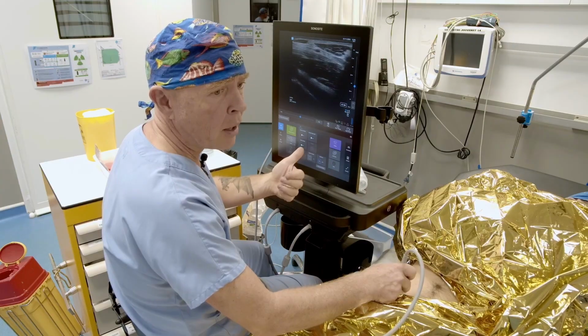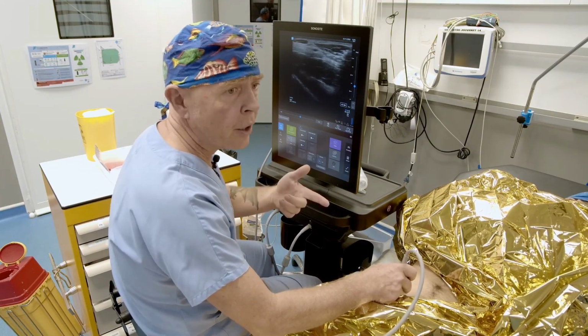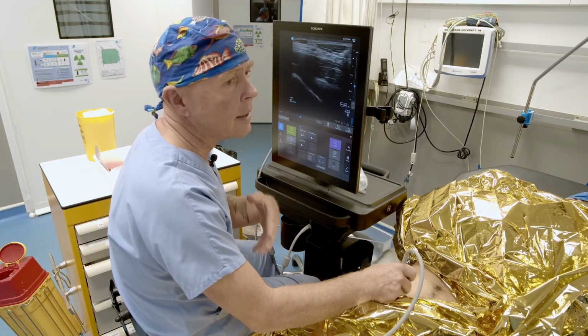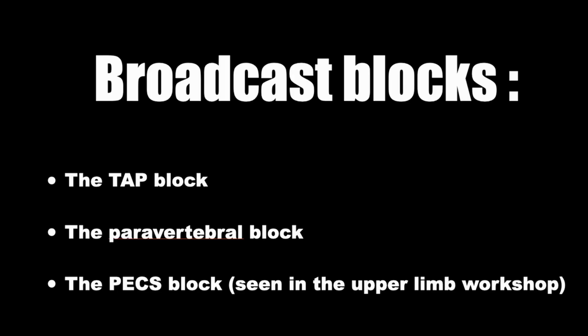So it covers the femoral nerve, right? The obturator nerve and the lateral cutaneous nerve of the thigh. So get familiar with this block. It's one of the most promising blocks and currently provides the most benefit.